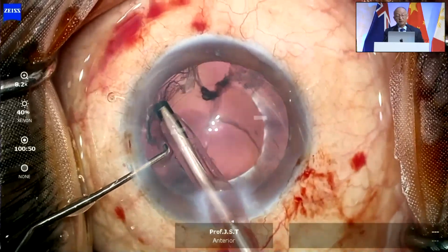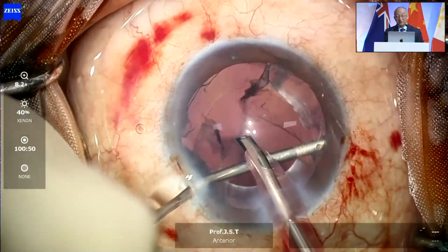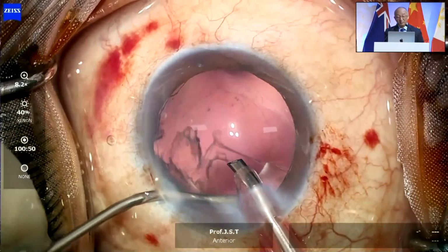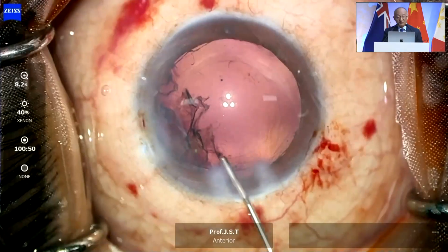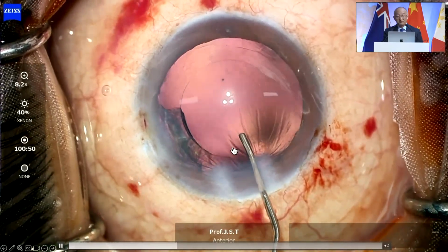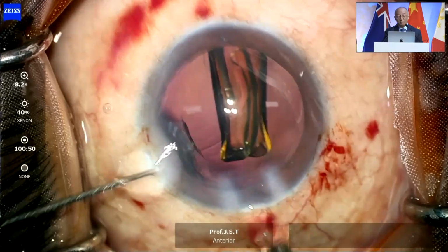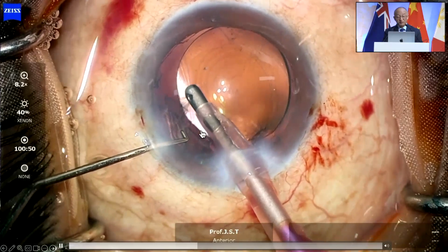Aspiration of this cortex can be tough sometimes. Therefore, I am doing a hybrid technique of taking out the cortex, because once the cortex is cut with the laser, aspiration is sometimes difficult. Bimanual aspiration is definitely easier in these cases also. This sub-incision cortex can be difficult to remove. I left the fibers here. I'll be injecting a trifocal toric lens in this patient, which is effectively going inside now. Once I've implanted, I thought I'll do a viscoelastic removal and remove this chunk of cortex.